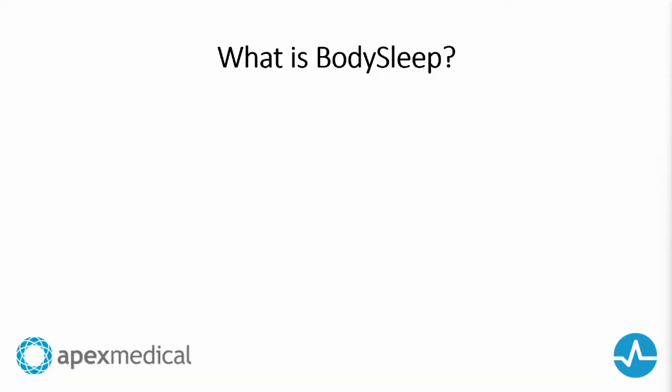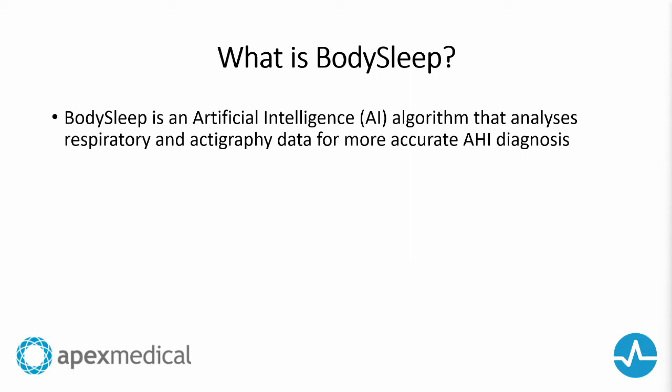First, we have to answer the question, what is BodySleep? BodySleep is an artificial intelligence, or AI, automatic analysis algorithm that analyzes respiratory and actigraphy data for more accurate AHI diagnosis. Nox chose to use these signals as inputs as they are unlikely to fail during a sleep study. The primary input is the respiratory data, which is processed through Nox's algorithms using calibrated RIP or C-RIP technology.